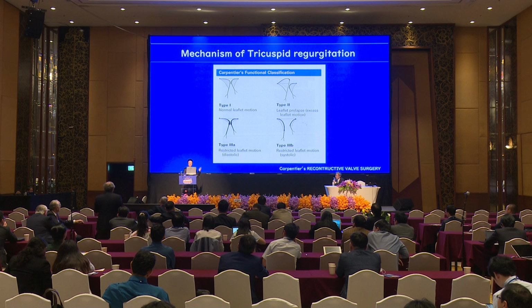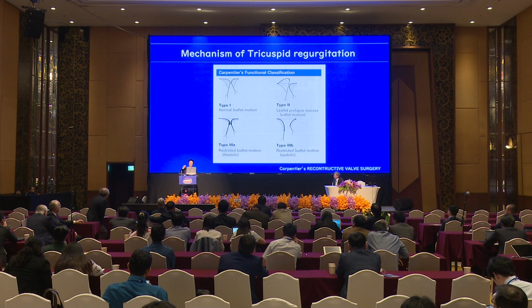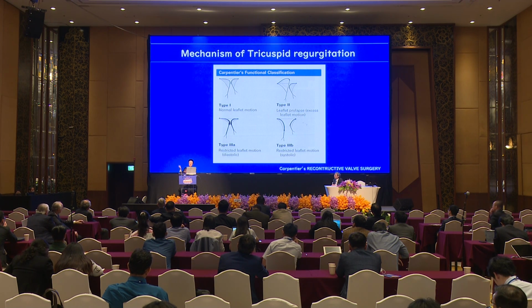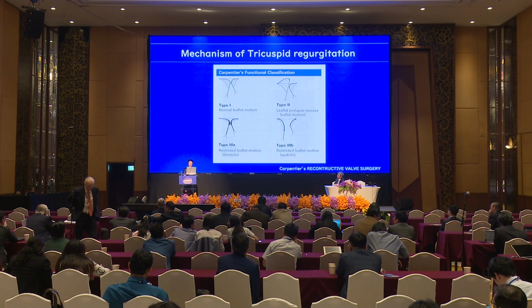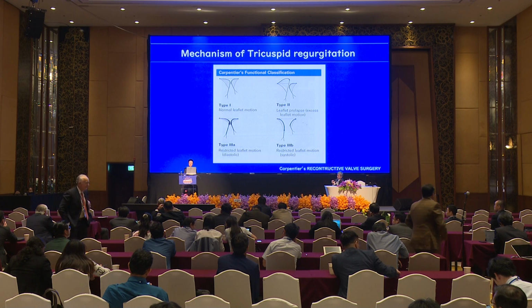In the third case I presented with autologous pericardium, I cut from anterior to the posterior, and then the thickened pericardium caused a disaster, creating functional TS. So I decided not to cut the posterior leaflet, but recently I'm using a little bit bigger patch to enlarge the anterior leaflet. Without cutting into the posterior leaflet, if you use a bigger anterior leaflet, probably the coaptation length is going to be longer without causing the functional stenosis. That's what I think.